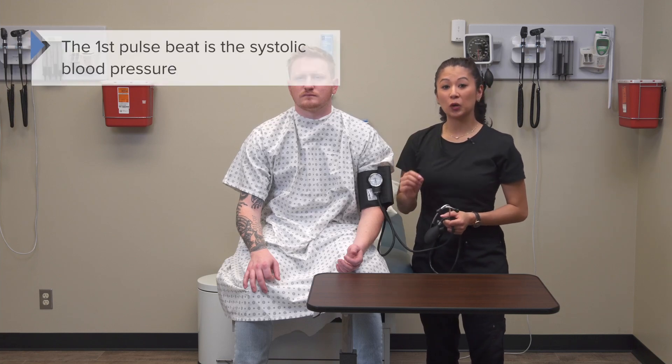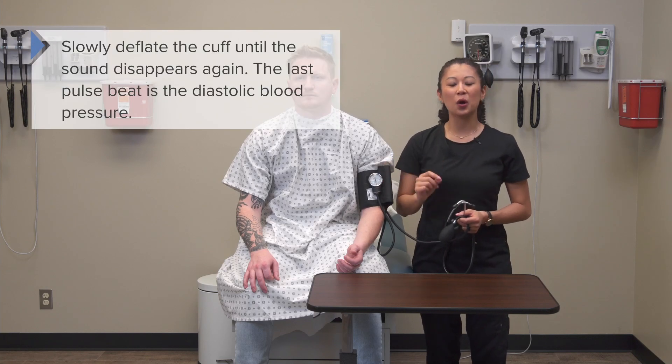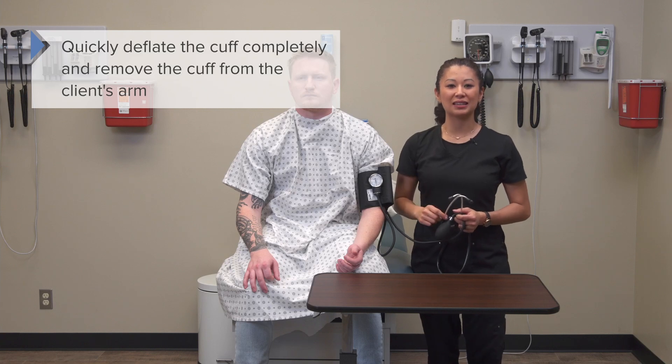Once the cuff is inflated and we're slowly releasing the valve, keep your eyes on the gauge. The first pulse beat you hear is the systolic blood pressure. Then you'll hear beat, beat, beat — and the last beat you hear is noted as the diastolic blood pressure. A key tip: when you first start releasing, the needle may jump, but wait until you hear that first actual pulse beat for the systolic. The last beat gives you the diastolic. Then slowly and continually deflate until you obtain your reading, and quickly deflate and remove the cuff from the arm.